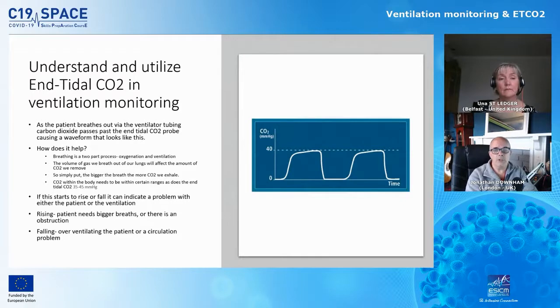When we intubate the patient, so when we decide to put a tube down, the crucial sign as to whether we've been successful and we're in the lungs and not in the stomach is the end-tidal carbon dioxide monitoring. So what you'll often see the team doing once the tube is in is turning and looking at the monitor and seeing when the end-tidal carbon dioxide is being produced. If it is, you're sure you're in the lungs. If it isn't, there's every chance that you're in the stomach, because the stomach doesn't produce carbon dioxide, the lungs do. So there's your waveform. Once the patient's intubated, that waveform will be up on the screen.